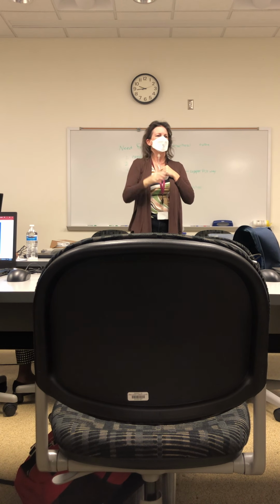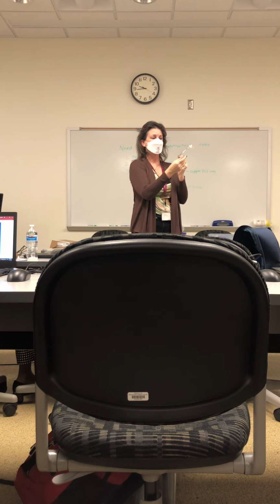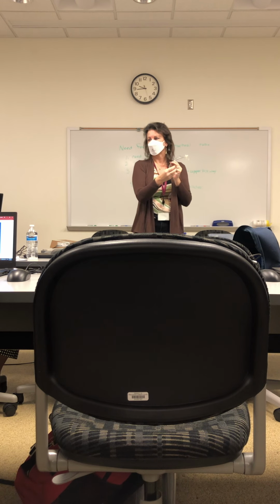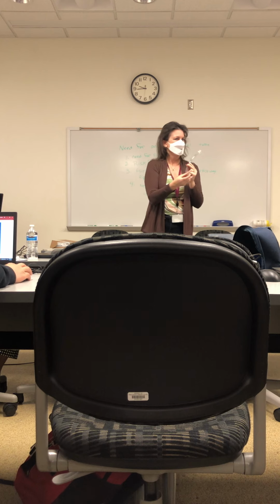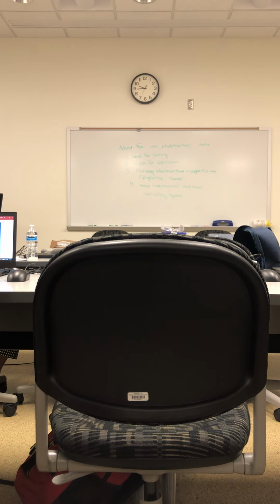In case it becomes obstructed? Yeah, so in case you have a thick mucus plug that blocks here, you still have access to get air through. So the Murphy's eye is an extra orifice in case your main port becomes obstructed, all right? So now we have checked our cuff, and we have a good cuff.